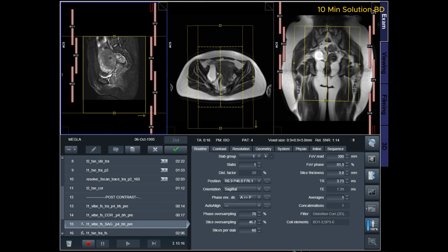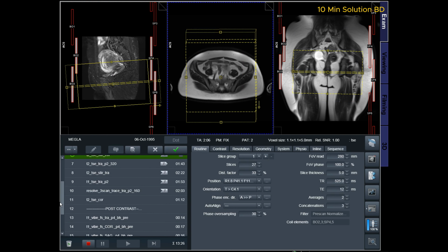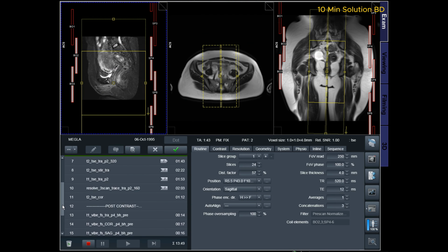Contraindications for endometrial MRI scans. Any electrically, magnetically, or mechanically activated implant, such as a cardiac pacemaker, insulin pump, biostimulator, neurostimulator, cochlear implant, and hearing aids. Intracranial aneurysm clips, unless made of titanium.